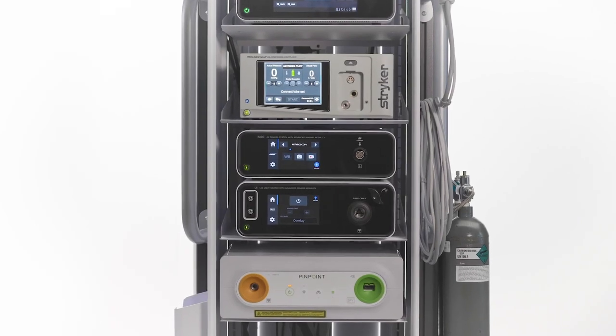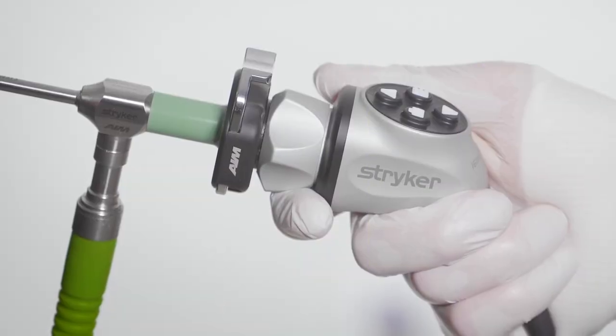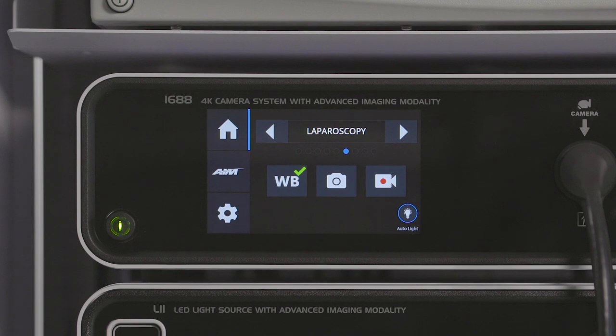The 1688 AIM 4K system features an advanced white balance workflow to streamline case setup. This workflow automatically turns on the light source when white balance is done from the camera head. This workflow can be disabled should the surgeon or staff prefer an alternate white balance workflow.